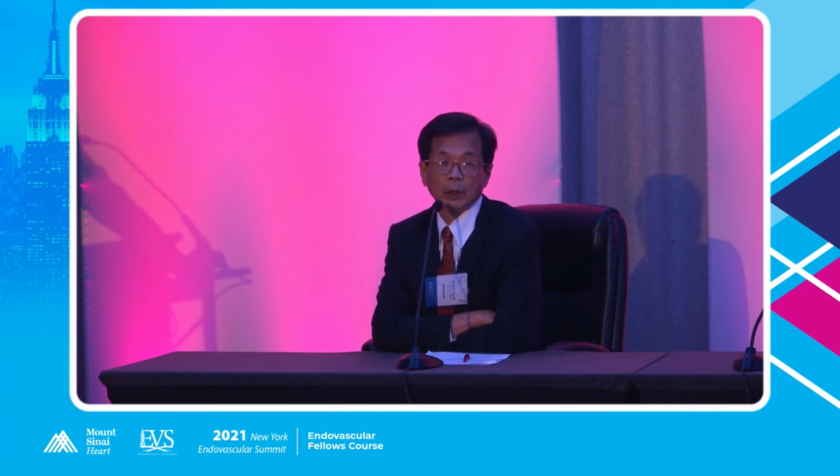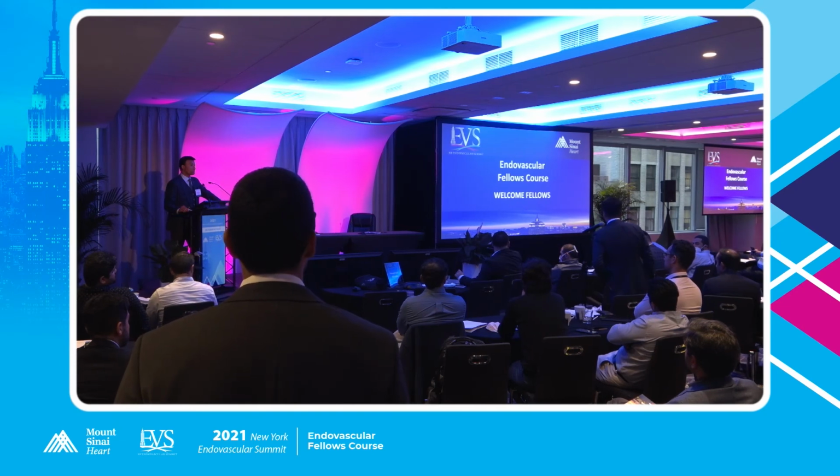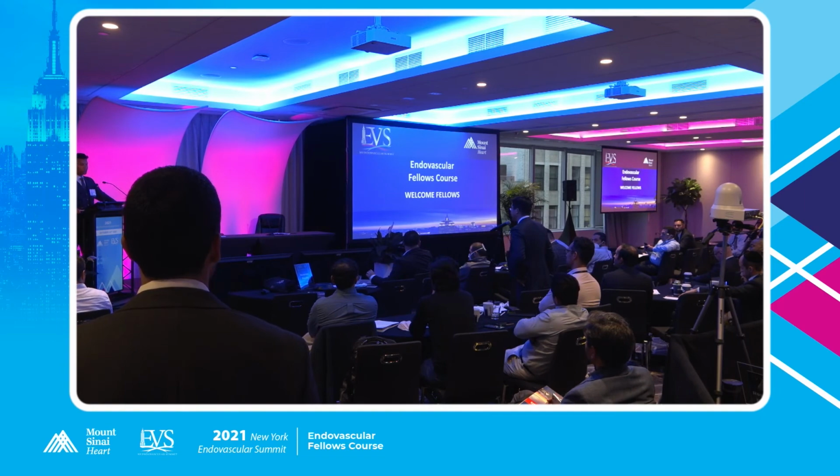Yeah, I think just the one last caveat to add to that is, when people talk about stenting into the common femoral vein, you're doing that for inflow into the stent, and your major source of inflow from the lower extremity is your profunda vein. So don't cover the profunda vein if you are extending down to that region.